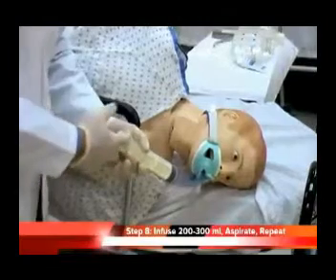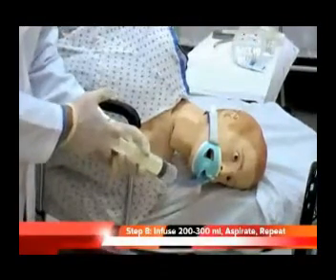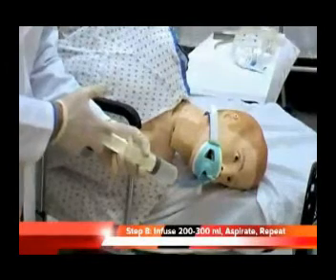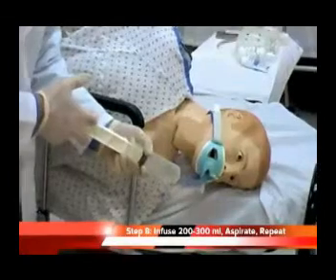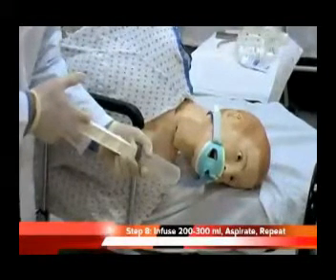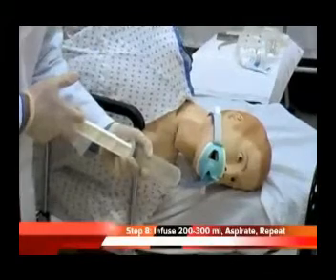Some toxicologists advocate administering activated charcoal prior to lavage so that any drug that passes into the small bowel will be absorbed to the charcoal, but there is little evidence to support this practice. Repeat this process of 200 to 300 milliliters in, 200 to 300 milliliters out until the fluid you are aspirating is clear of particulate matter.